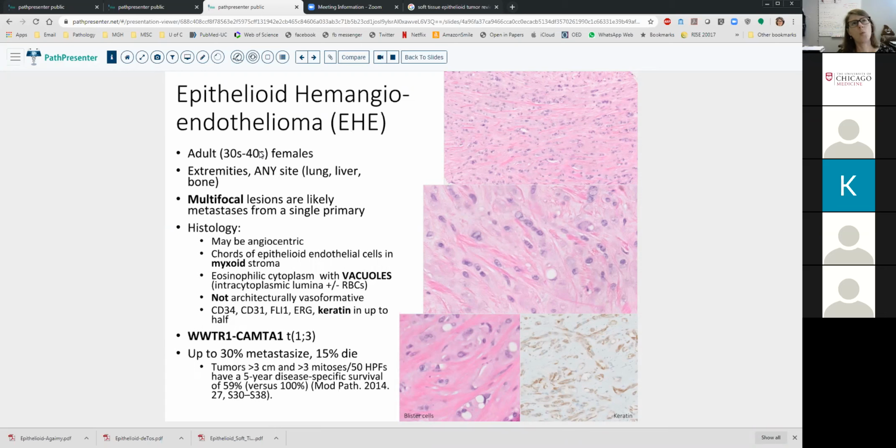So remember, what does the term hemangioendothelioma imply? Arising out of a vessel. It has an endothelial morphology. Okay, so it's of endothelial lineage, and specifically, what else does hemangioendothelioma imply? Low malignant potential. Right. So this is in the spectrum of vascular neoplasms. There are benign angiomas, malignant angiosarcomas, and intermediate or indeterminate malignant potential hemangioendotheliomas. So just remember that as your category, right?